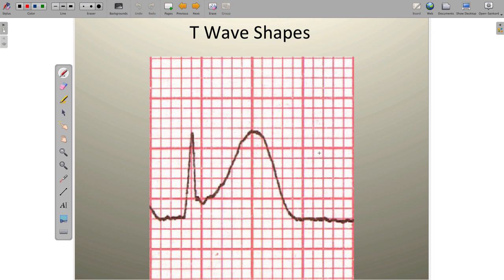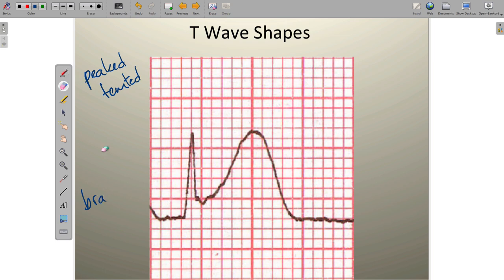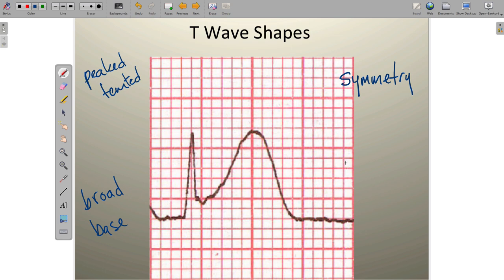Last but not least, we want to look at the T wave itself and see the changes associated with it. There are going to be four really important changes to look for. The first is a peaked or tented T wave. The next is a broad base. Then we're going to look for symmetry of the T wave. And finally we're going to determine if the T wave is hyperacute. Let's explore each of these independently.